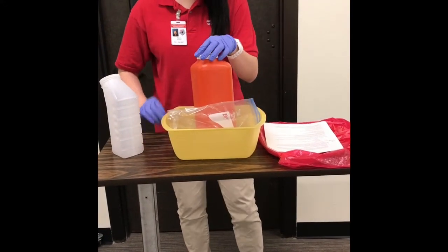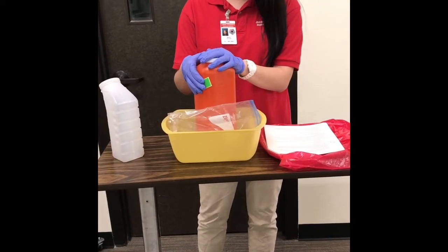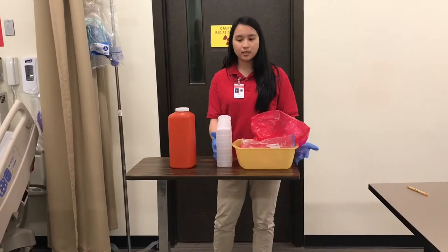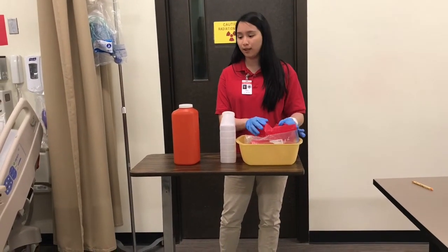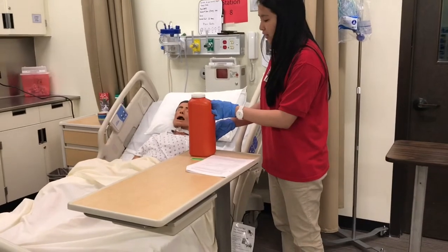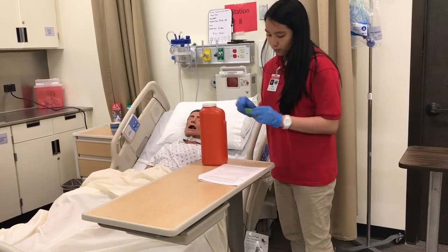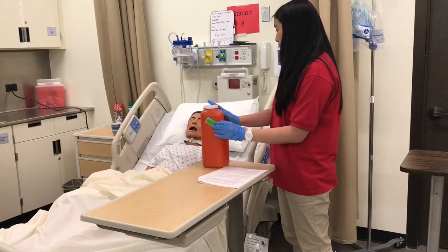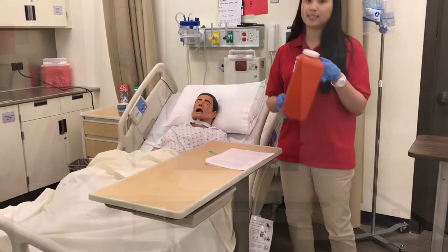I'll make sure to label the jug with two patient identifiers, the specimen source, collection date and time, and the number of the bottle. Once we finish the 24-hour collection period, I'll take all contaminated items and put them inside the biohazard bag and discard according to hospital policy. We've now finished the 24-hour collection period. I'll label the jug with two patient identifiers, the specimen source, collection date and time, and the number of the bottle. The bed is low and locked, call light is given, and now I'll take this to the lab.